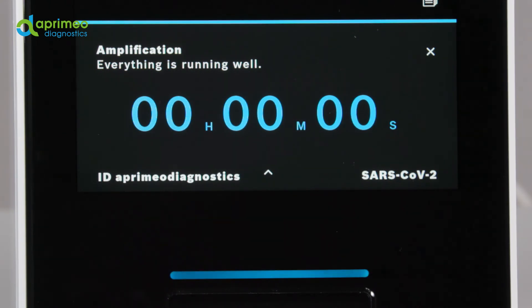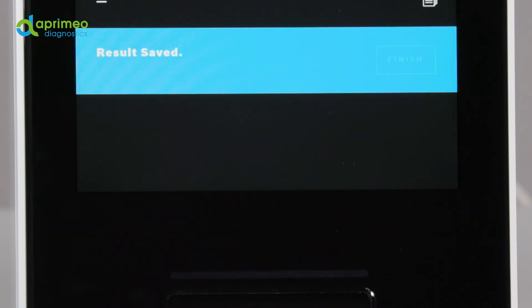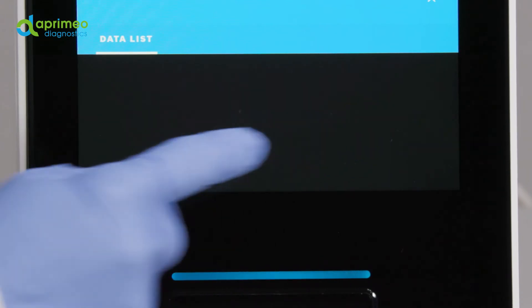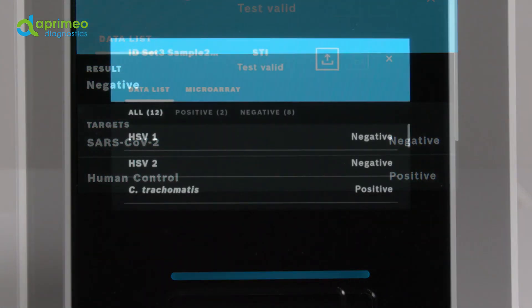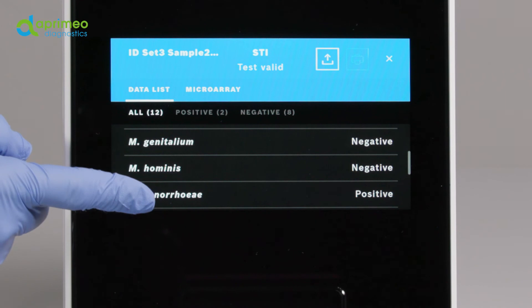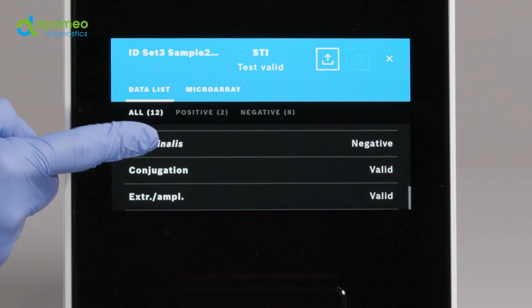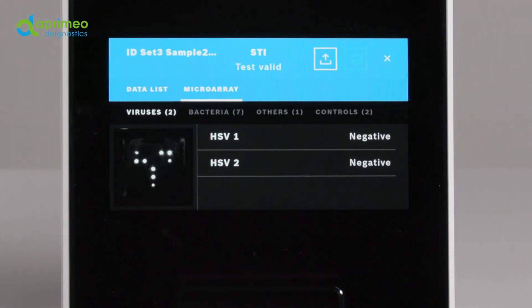That's why a diagnosis should always consider symptoms and other parameters as well, and only a doctor should make a diagnosis. After the test is finished, the result overview is shown on the display. First of all, the test is rated as valid — meaning successful — or invalid, meaning erroneous. Select details in order to view the complete list of data. Which data are available depends on the respective test. Positive means that the target was confirmed; negative means that no such presence could be detected. For displaying further details as raw data, select the tab next to the data list.